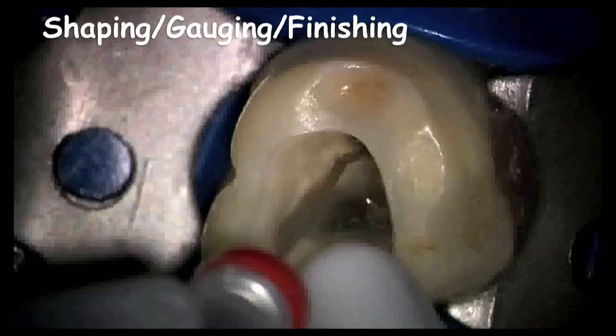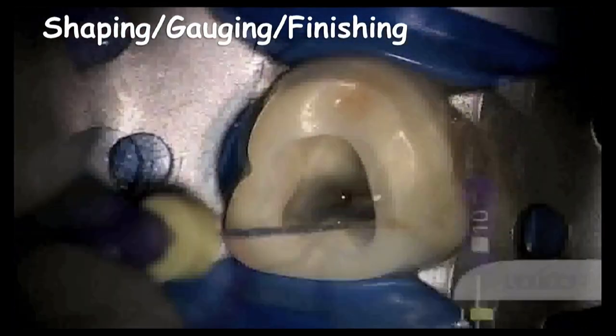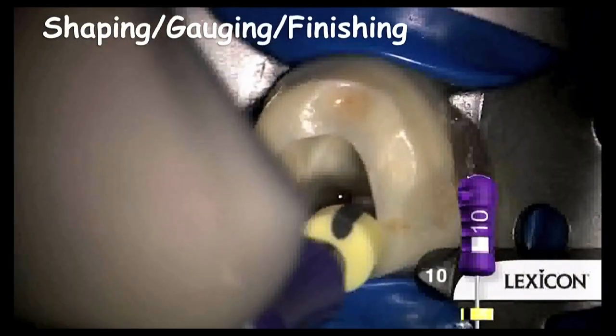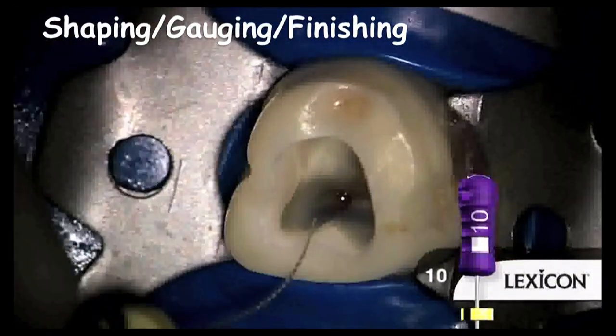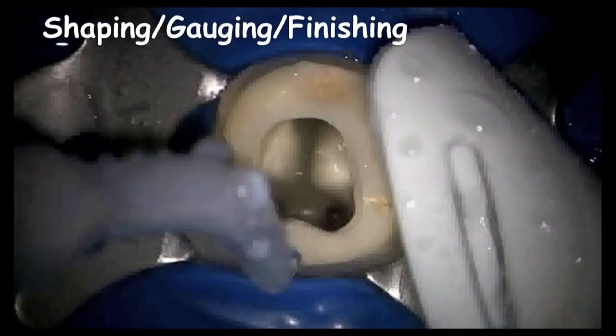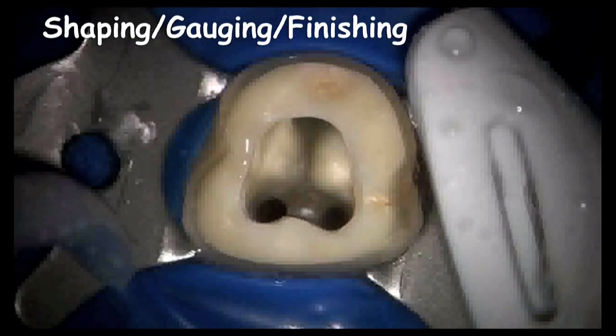Flushing, and you come out, the dental assistant is trained to flush the chamber every single time, whether it's a hand file or rotary. Now we're confirming patency, making sure that it's clear, although it almost always is clear after correct use of rotary, but still we want to be absolutely certain.